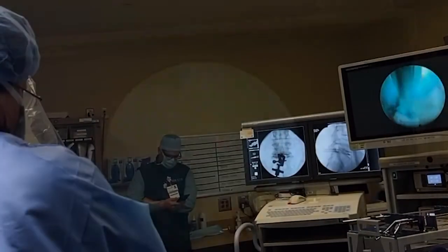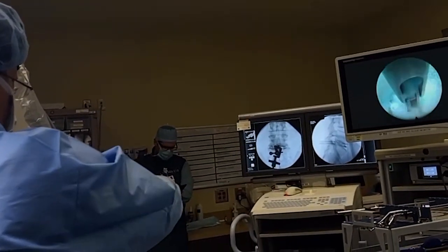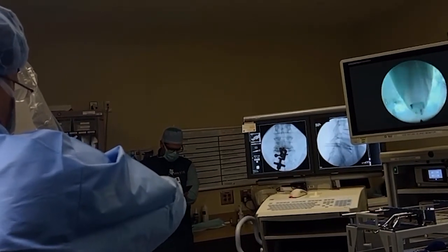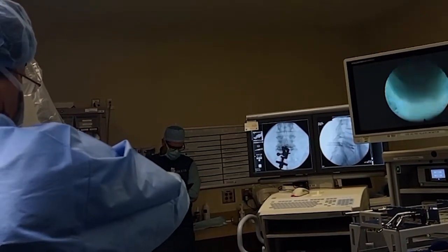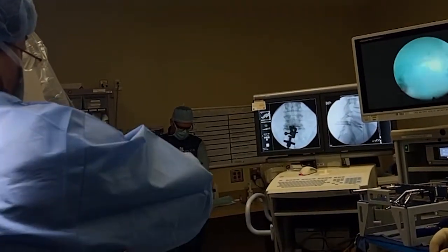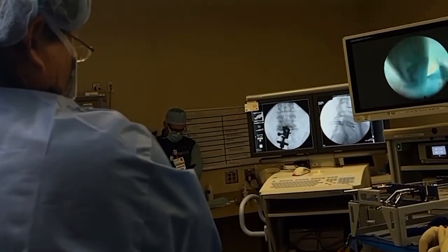Oh, look at that piece. That's the kind of piece that causes pain. Come on. It's hard. Come out. It's angry. It's petulant. I'm really glad we're doing surgery because this is the type of disc herniation that will not resorb on its own because it's stuck to the annulus. A lot of it is annulus, not just pure nucleus material. And it also makes it more annoying to take out, for both me and your body.